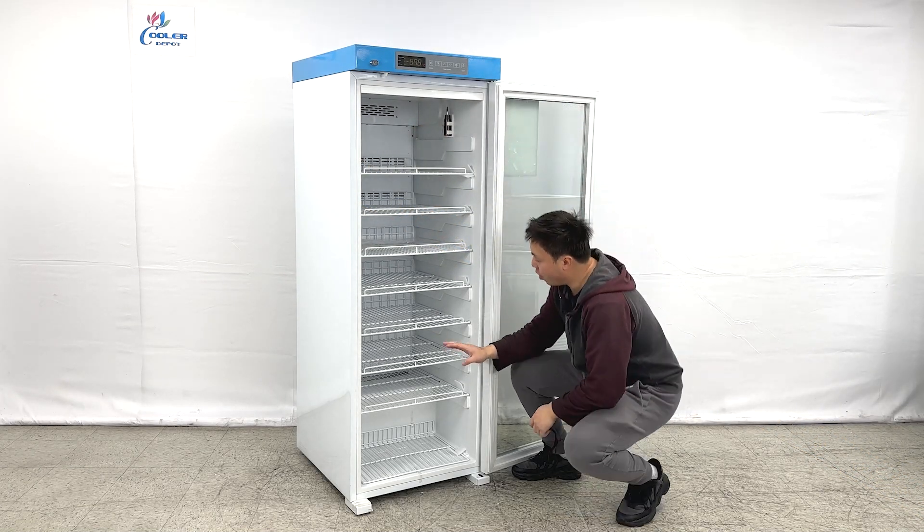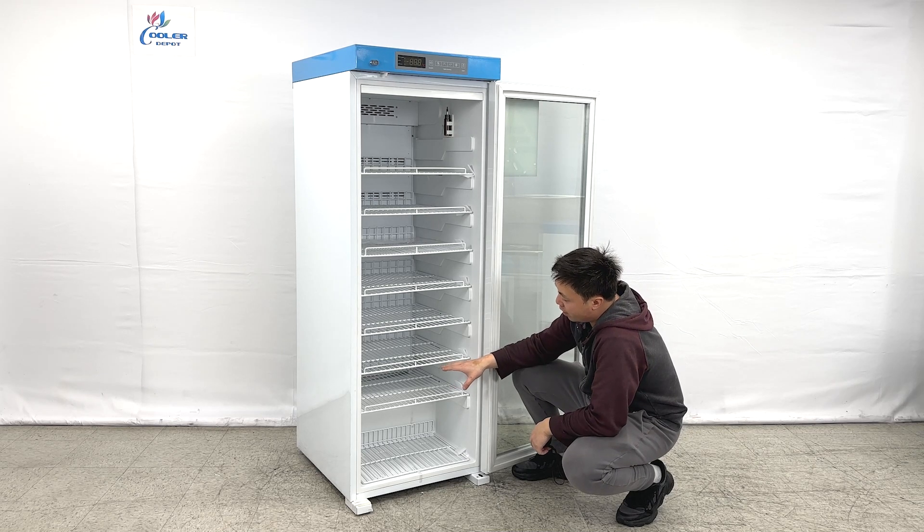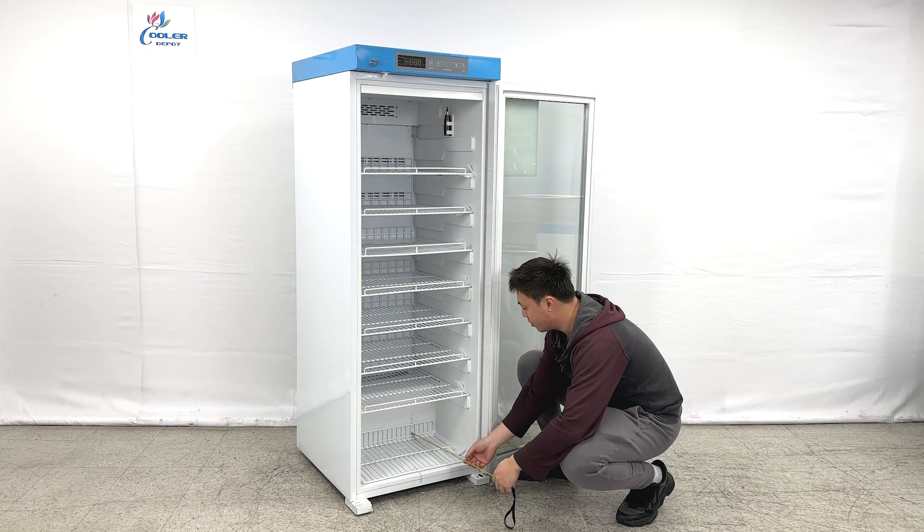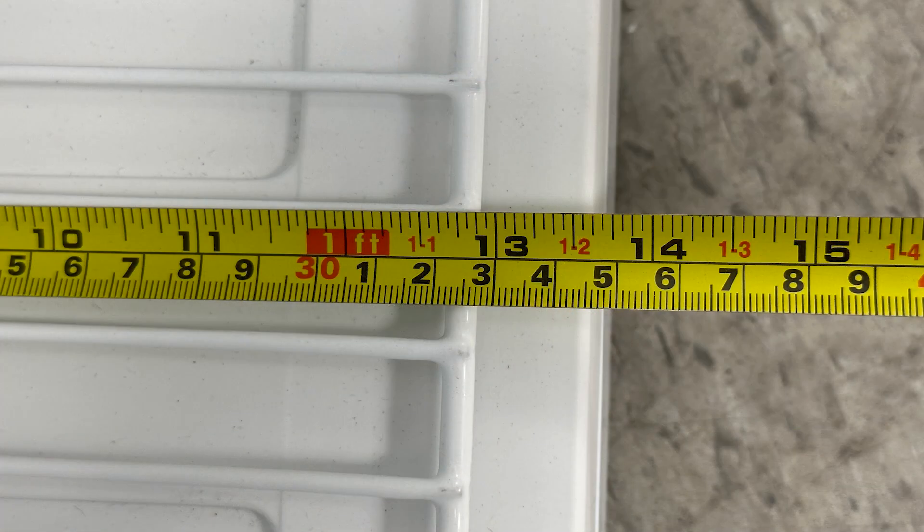Now looking at the bottom of the unit, we do have the compressor system mounted at the base. For the last layer, it is about 13 inches deep.